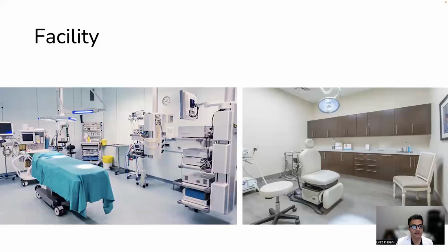So in terms of facility and equipment, this procedure, liposuction under local anesthesia, can really be performed safely in 2 settings. It can be performed in a full operating room environment. Typically, practitioners prefer, unless you have an operating room in-house, not to perform liposuction under local anesthesia in an operating room environment because you really don't need the general anesthetic, and it can come with significant OR costs.